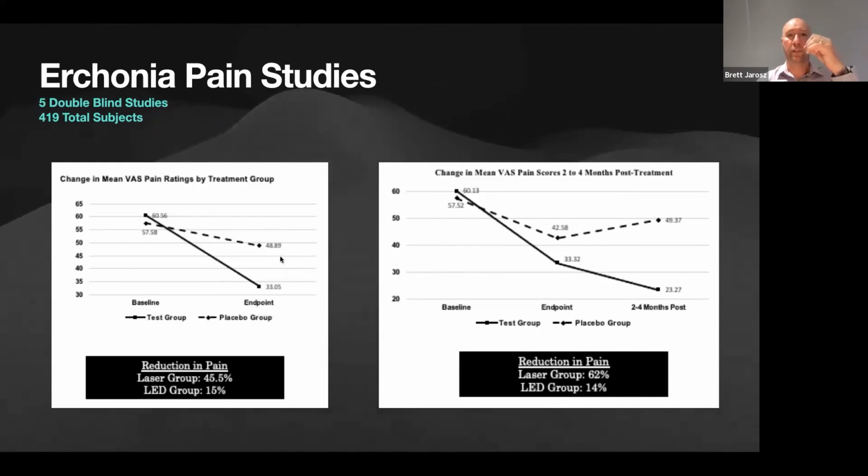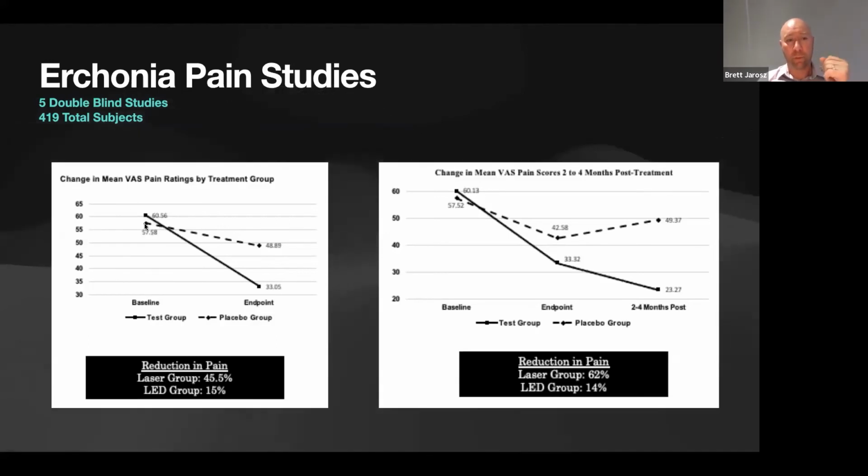All right, because it's not that directionality from the LED. We've got more scatter. All right, we're not going to be able to absorb as many photons. So the laser with that directionality, with that wavelength, we can see here the wavelength from the LED, dotted line. We got improvement, but not as good an improvement as the laser. I want to come back to how we get clearance for that.